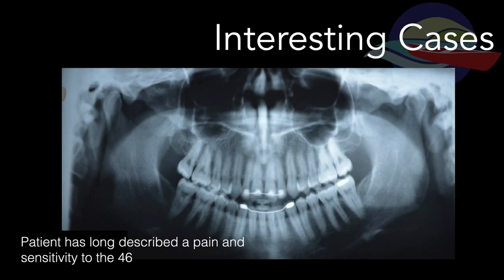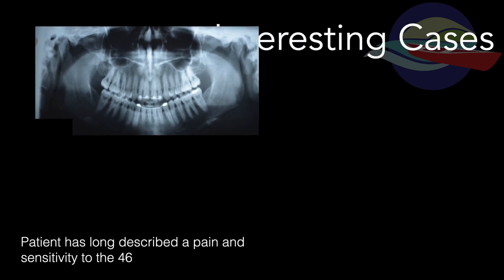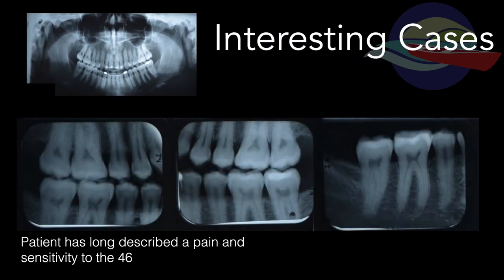In this first case, a patient has long described pain and sensitivity to the 4-6. They brought to their appointment a PAN and PAs that had been taken prior. You can see from the PAN that this patient has had ortho and has healthy bone levels. From here, we don't see any obvious pathology — so what is going on at the 4-6? If we take a closer look at the PAs, there is no overtly obvious issue here for what could be causing that pain and sensitivity.